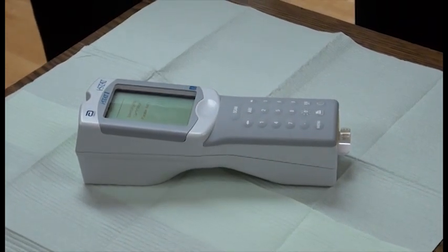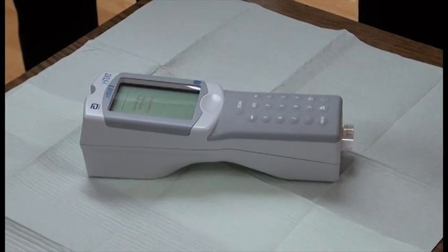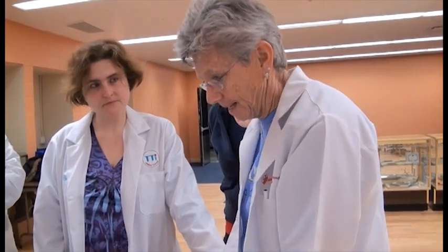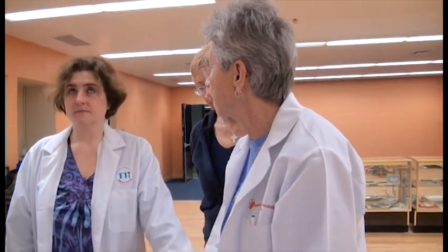Every four months, I get an update from Abbott and I have to update the handheld. It's going to identify this. Now we're going to get an error, obviously, because there's nothing in this cartridge. Once it identifies the cartridge, it will do the testing of the blood, and in 120 seconds or two minutes, you get the result. So three and a half minutes total.